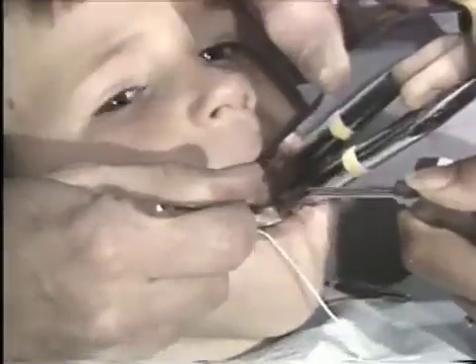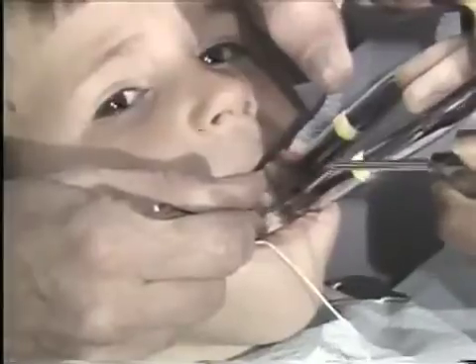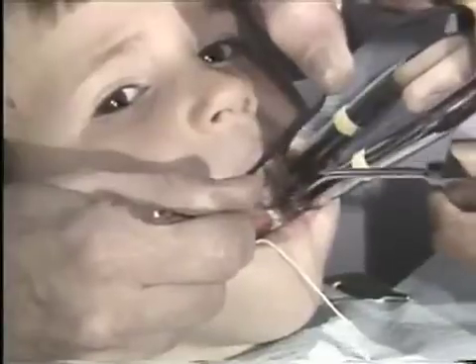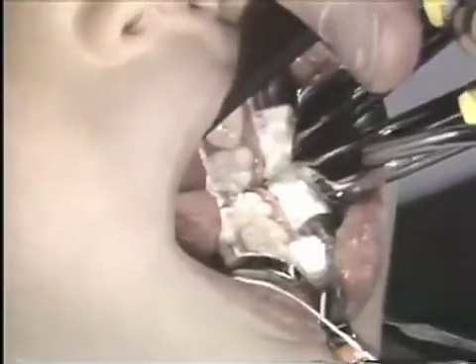A third increment of acid is placed at about 40 seconds, and then at 60 seconds we rinse the surface carefully using water and the high volume evacuator for a thorough rinsing period of about 20 seconds. Once rinsing is completed, the assistant switches from water spray to straight air. We can then look carefully and see the whitish opalescent color of a properly etched surface extending through the grooves and out into the planes of the fissure.